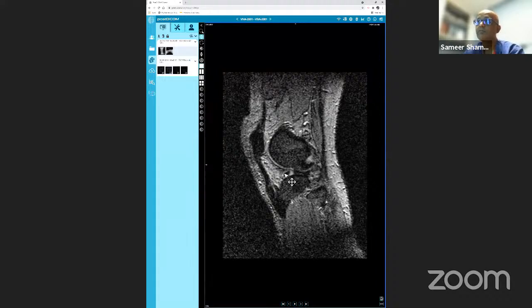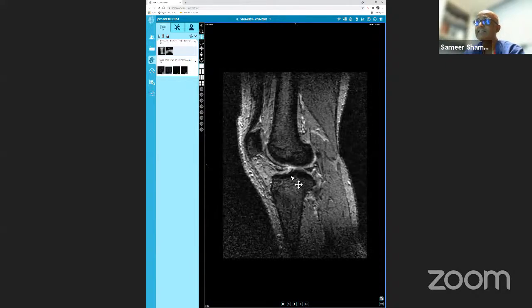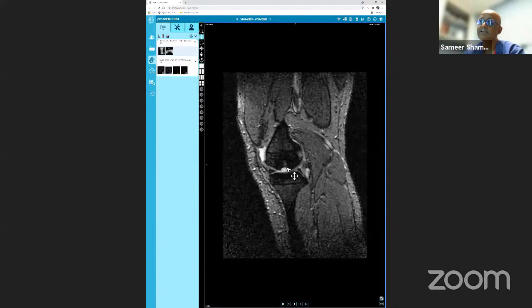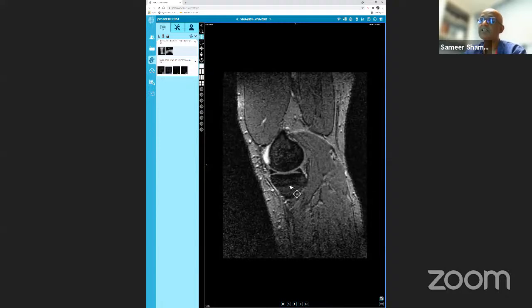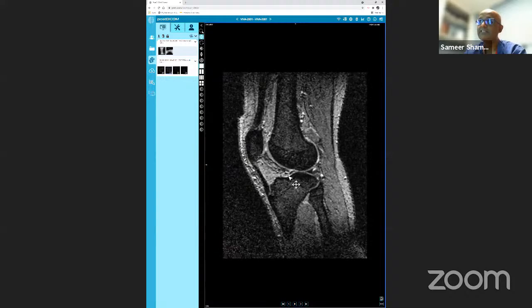So this is a cortical bone. It's as black as the bony cortex here, and it is sitting here. The dimension of the bone fragment is very similar to the defect size itself. You can see that that's the defect, and there is only fluid in it, so you don't see a bone fragment. In the exam, you're allowed to say that I can see an osteochondral lesion in the medial femoral condyle, but I don't see the bone fragment in the defect, so it must have gone out. If the patient has got a locked knee, I would expect to see the bone fragment. And that's what you're going to do. You hunted it down and it is seen here.